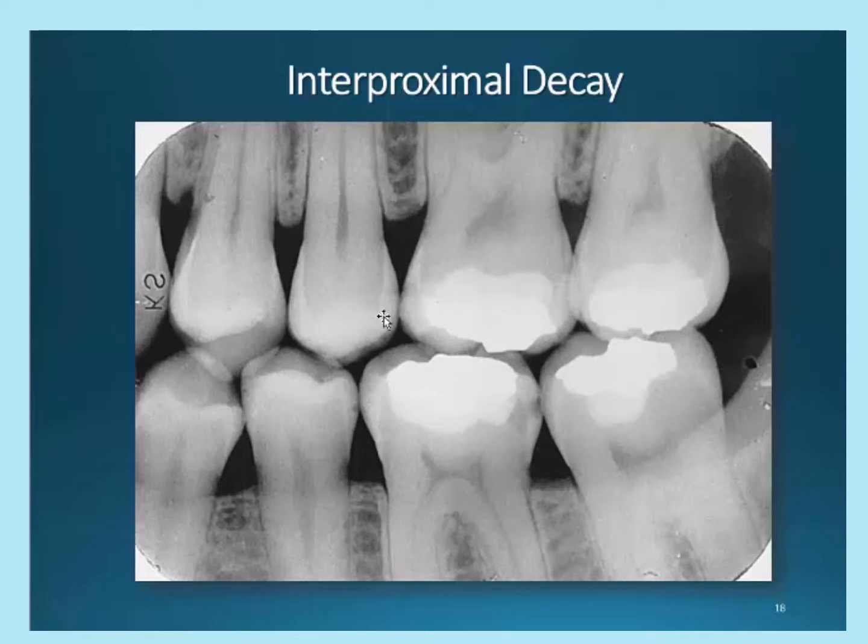Tooth number 13 has a class 2 on the distal. The lesion is more than 1/2 way through the enamel and may be worse than a class 2 when restored. I do not see any penetration into the dentin of this tooth, but the dentinoenamel junction is still quite visible. When this area is restored, the decay may be much worse than visibly seen in the radiograph. Tooth number 14 has a class 3 on the mesial surface. The distal has an overlap and therefore makes diagnostic interpretation impossible.